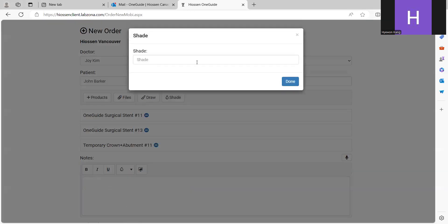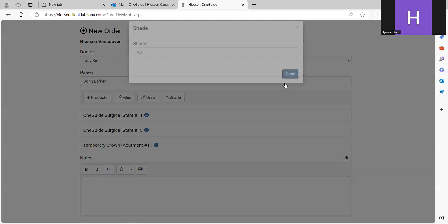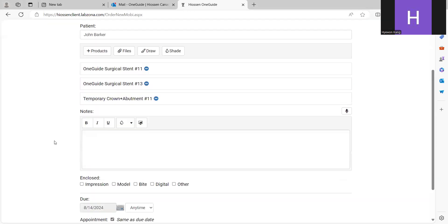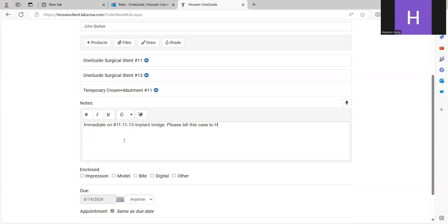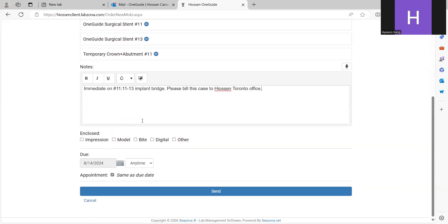And then you can add some shade. If you have special instructions, you can also put some notes here. Immediate on 11, 11-13, implant bridge. Please bill this case to Hiossen Toronto office. And I attach the digital files. Click the digital.